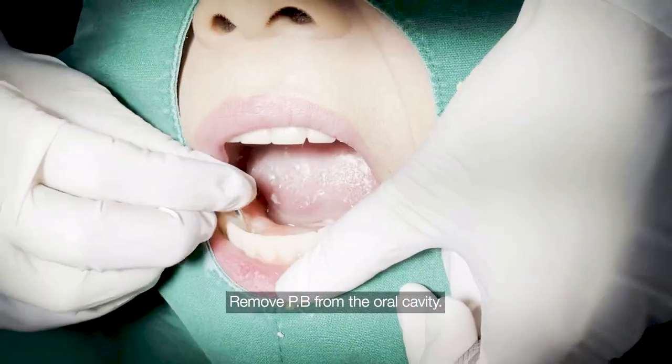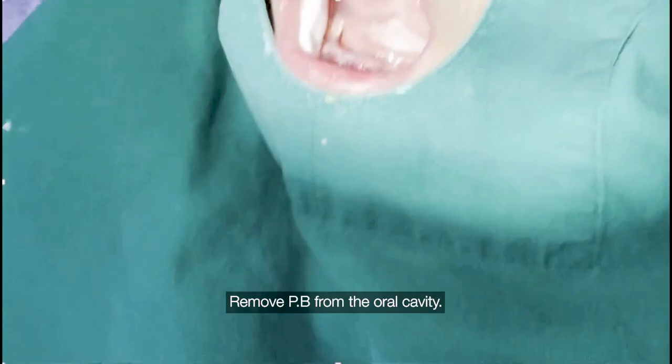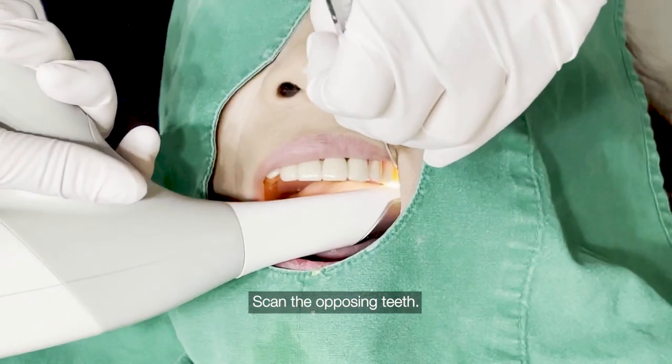Remove provisional bridge from the oral cavity. Scan the opposing teeth.